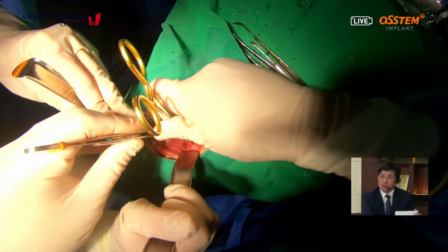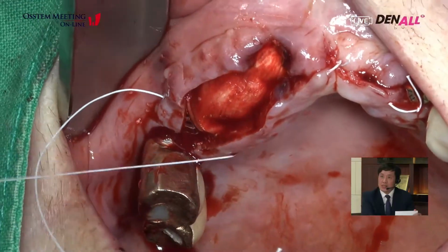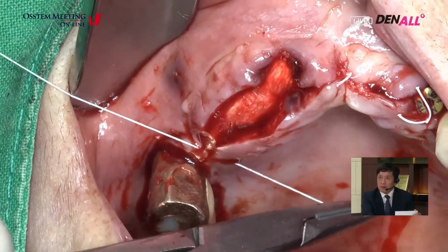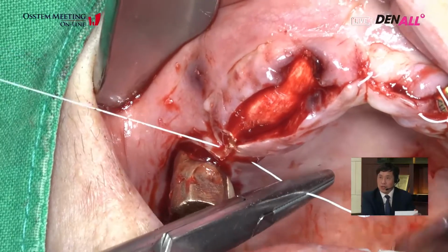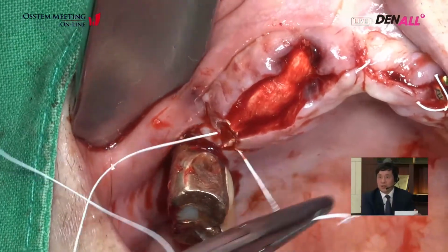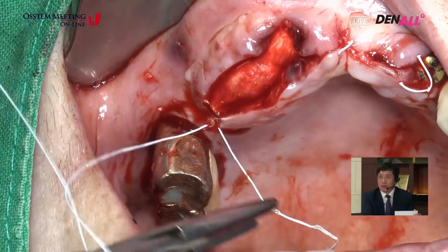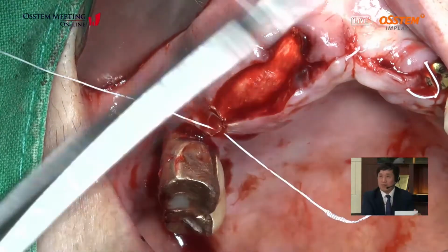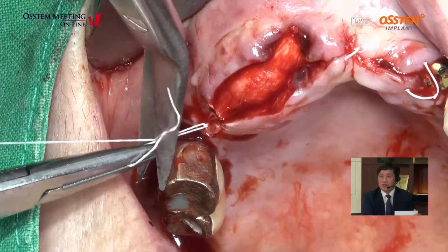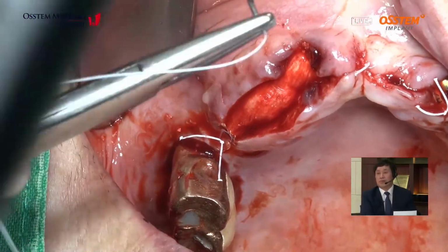He will do the suture of the right side, and you can see there is no tension. I think the periosteal releasing incision is very important for good approximation of the flap. There is no tension, and the key suture of the right premolar area.